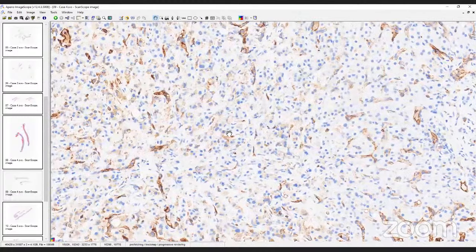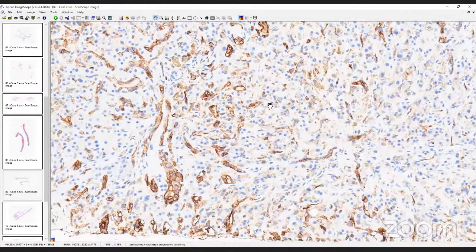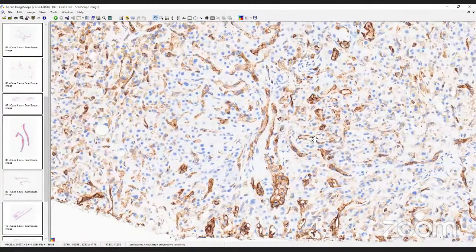So this is a very good example of an epithelioid hemangioendothelioma in the liver, a very distinctive lesion, which is marked by a whole lot of fibrosis. So if you see a whole lot of fibrosis, it is one of the things that should almost always come to mind. And then once you've thought of it, you will start looking for the signet ring cells or the abnormal cells.